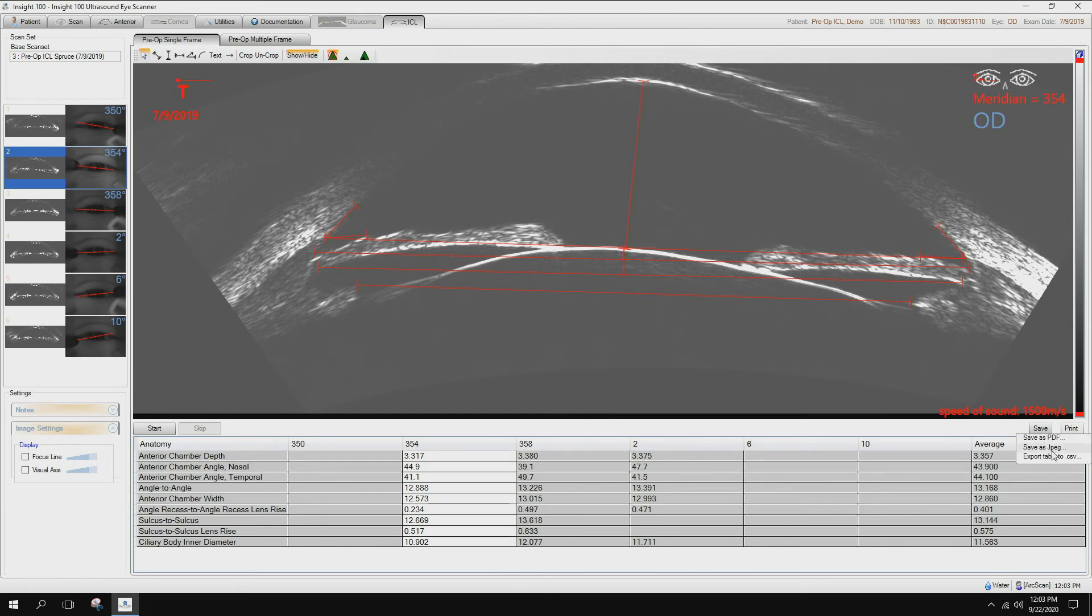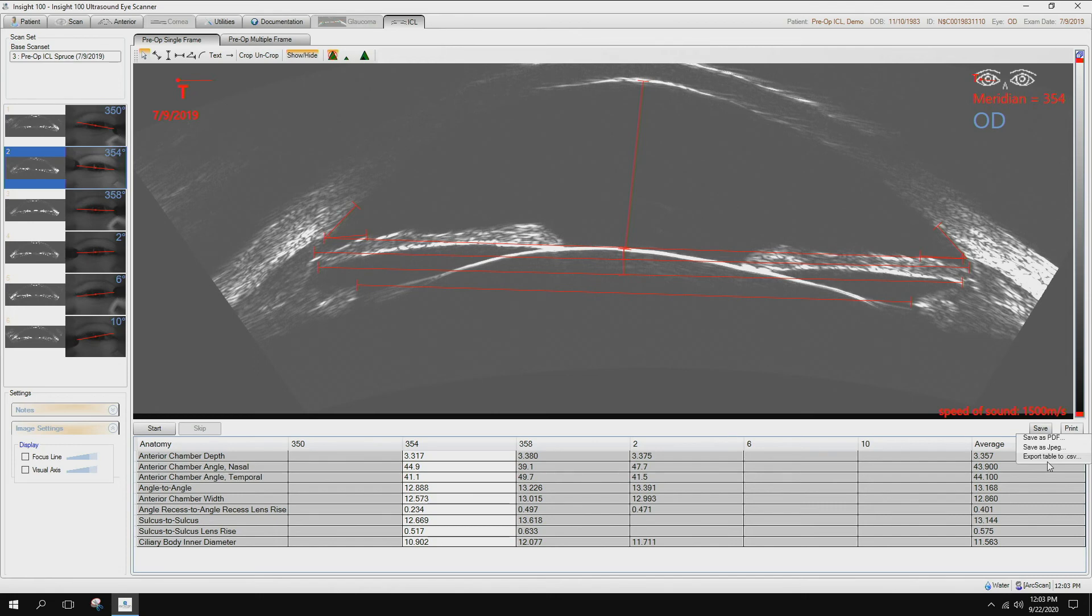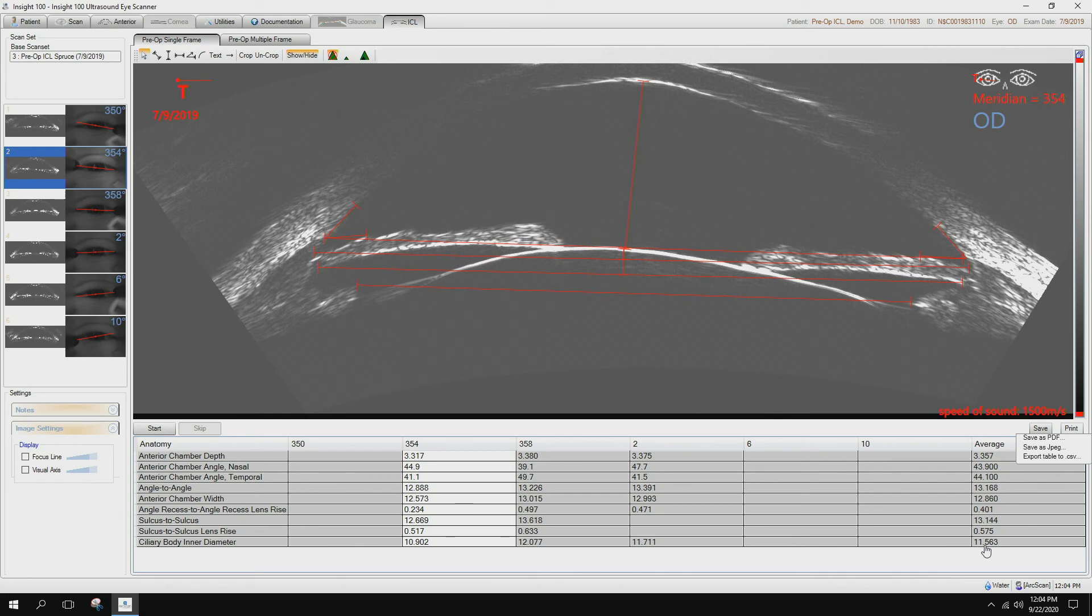Another option here, you can save it as a JPEG. Perhaps you want to export this into your PAC system. The third option is export to a CSV. That's an Excel spreadsheet file. So here you could print on another computer your Excel spreadsheet. And from there, you would simply go to iclsizing.com. That's London Vision Clinic's website. It's not associated with ArcScan. It's a free to everybody website. You would enter in all of these values on that website. When doing that, the report that that site will give you will be either the Kojima, the Doherty, or the Nakamura, their call-outs of the exact lens size that you need for your patient.